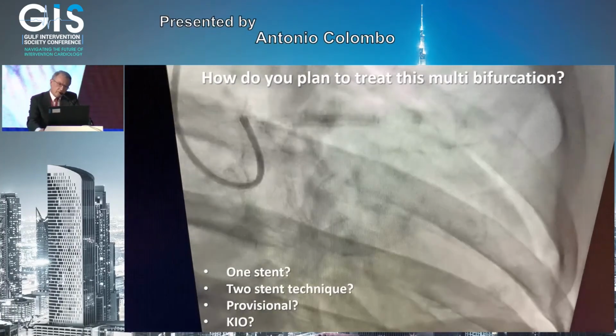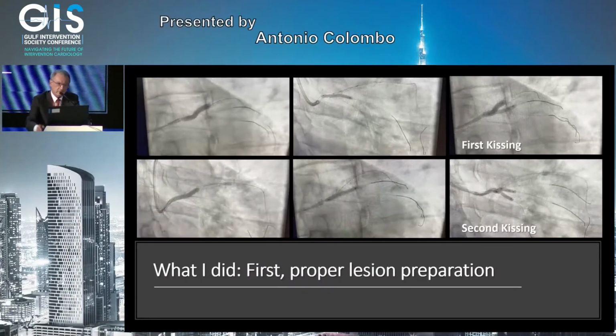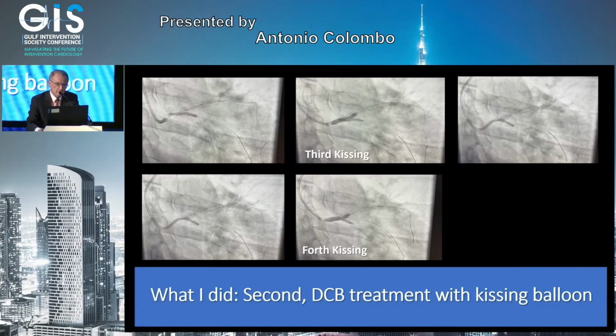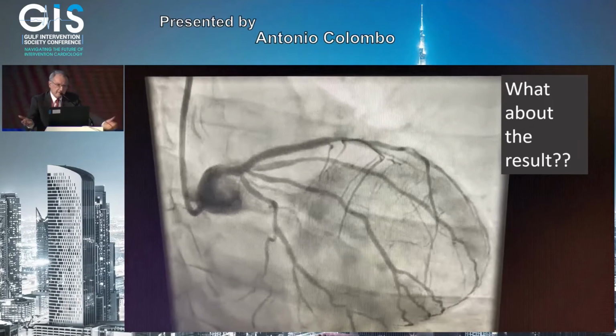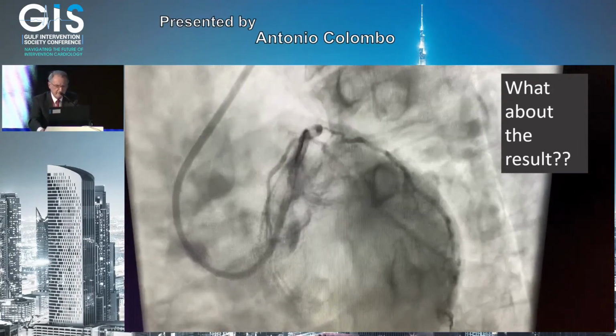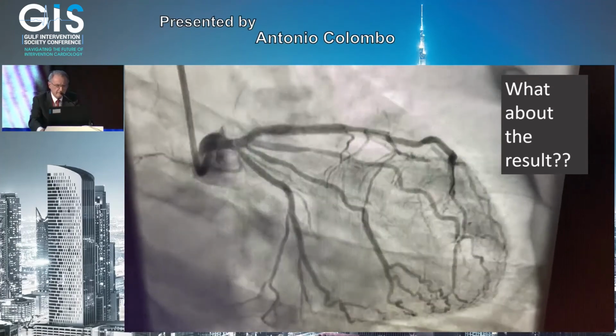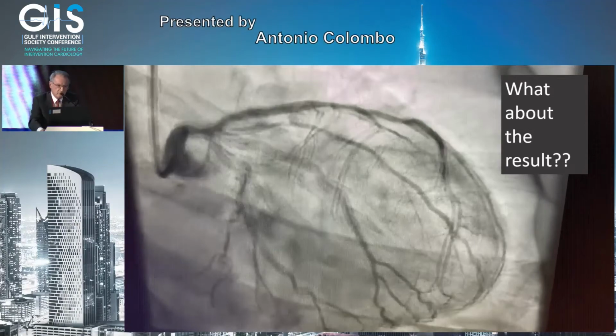Here it's a lot of work. If you do stenting, most of the time we will do stenting from the left main to the LAD, then provisional, we place 3 wires. We did lesion predilatation, and the results were so good after predilatation that it was very difficult to stent, and so we used 3 drug-coated balloons.